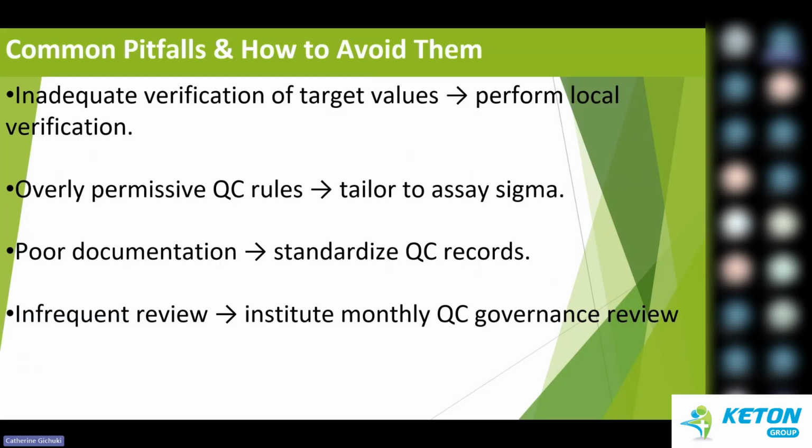Oh, we changed our reagent. Oh, it's a new lot. So how was the lot to lot? Did it compare? For example, after running the QC, there's a dip, so something is not right. It should be checked immediately, and then you set standards for that.